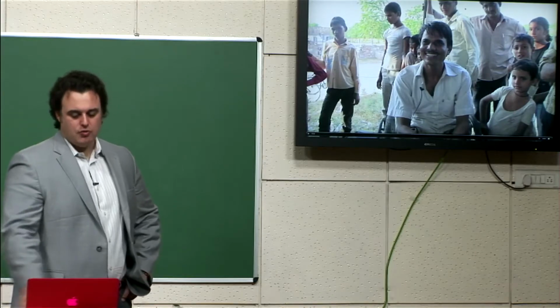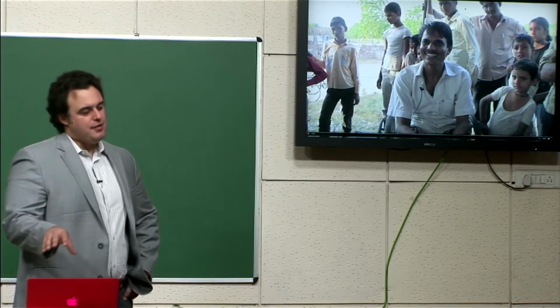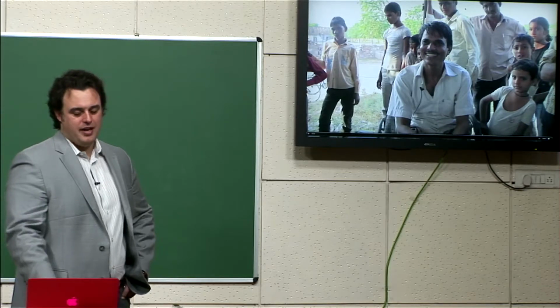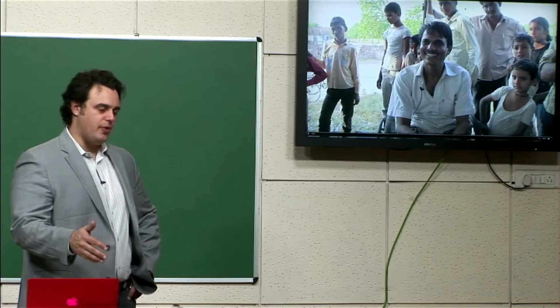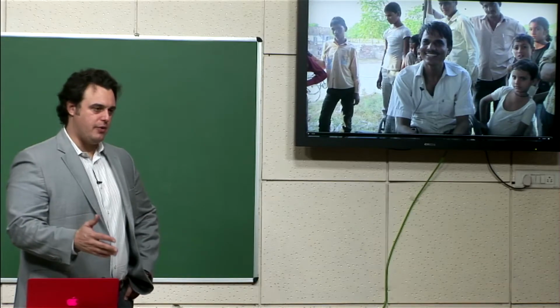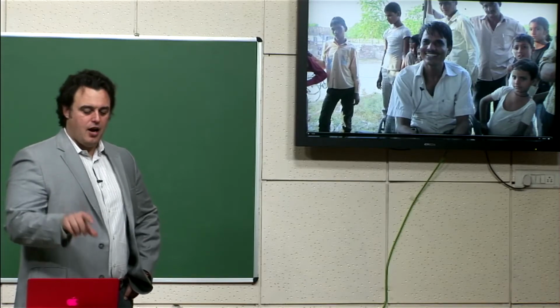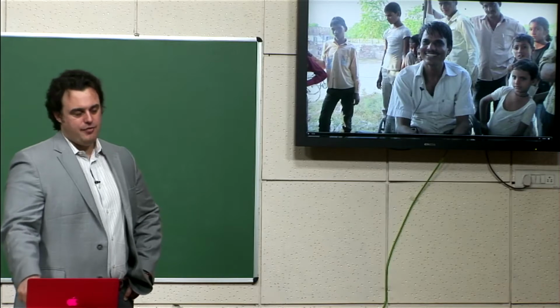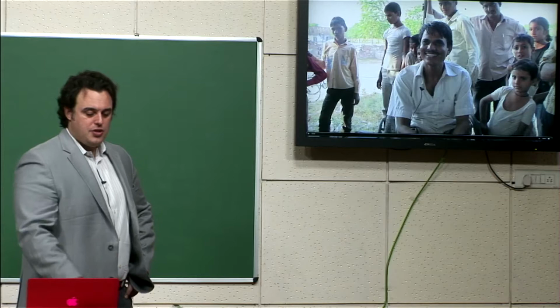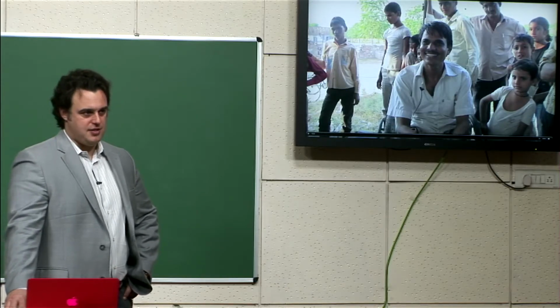We also had tricycle riders in the trial. Like I mentioned before, this really isn't for a person who already successfully uses a tricycle, particularly in an urban environment. Tricycles are much faster than our wheelchair, and those people typically can go short distances under their own power, like with crutches. But for our target market of wheelchair users, of those 11 people, 10 of them adopted the LFC as their primary wheelchair. When they were using a regular wheelchair, none of them could travel outside of their house without the assistance of a family member.